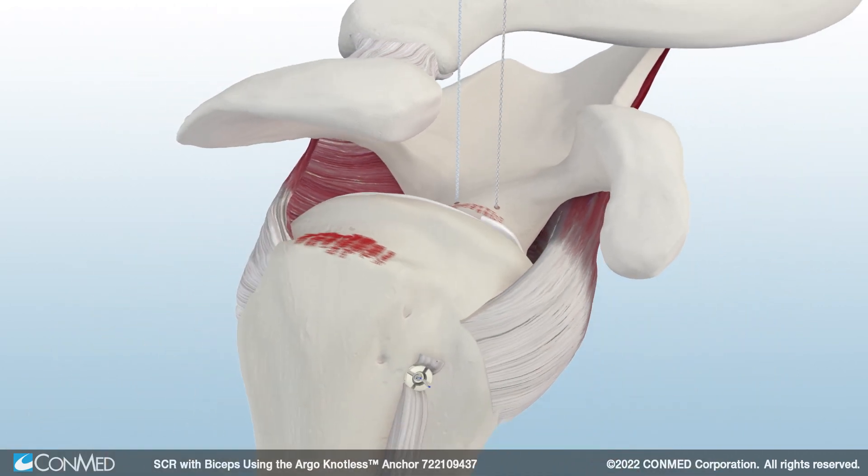Next, use an arthroscopic ruler to obtain graft measurements. First, measure the distance between the two glenoid anchors, and then measure the length of the footprint on the greater tuberosity. Then, measure the distance between the posterior glenoid anchor and the anterior greater tuberosity footprint.